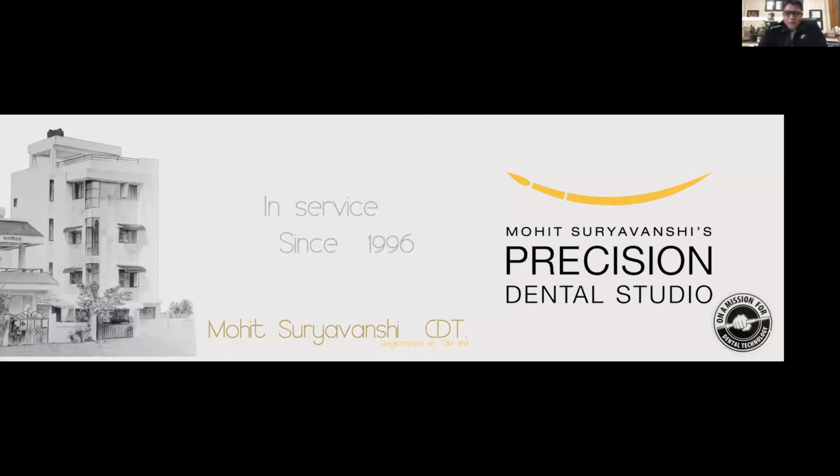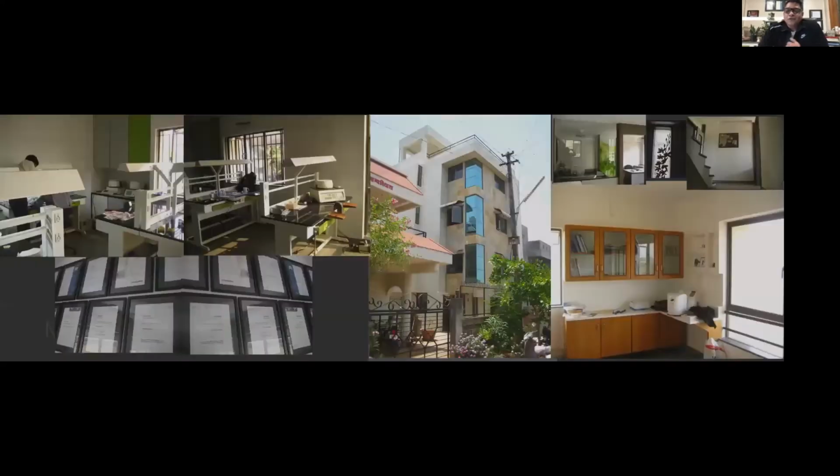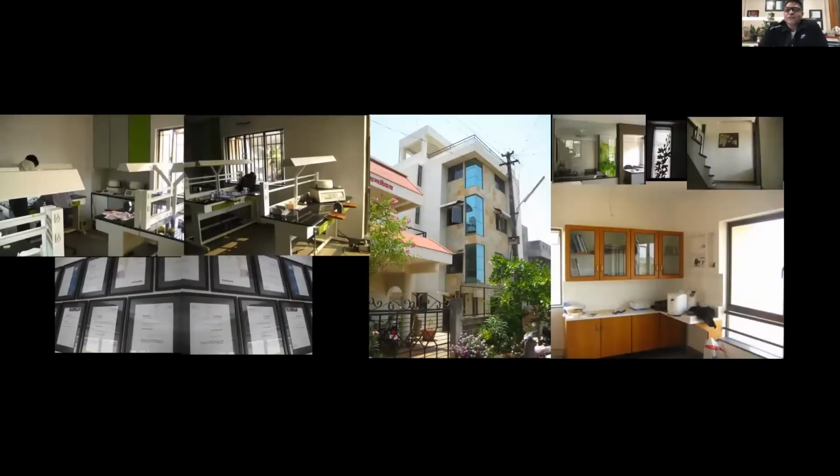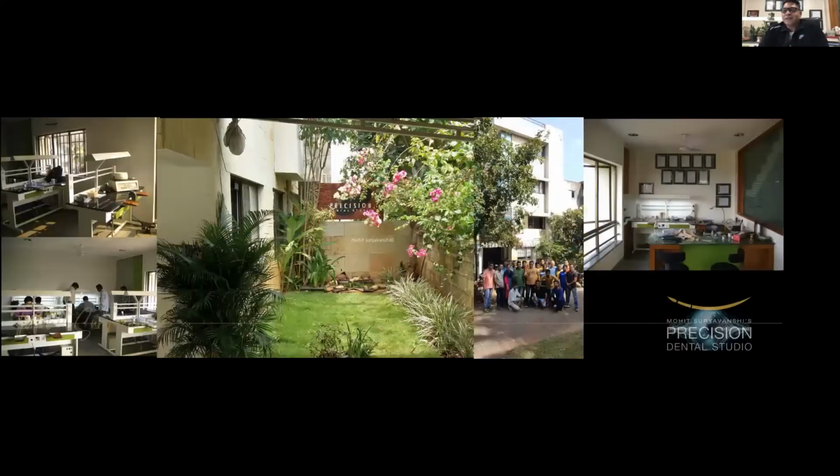To introduce myself, I'm a dental technician in India, and I am practicing in my own dental lab since 1996. A few glimpses of my lab. It's situated in a town called Kolhapur, which is south of Mumbai. That's the entrance of my lab. That's my team that you see. That's the cabin on the right hand side.